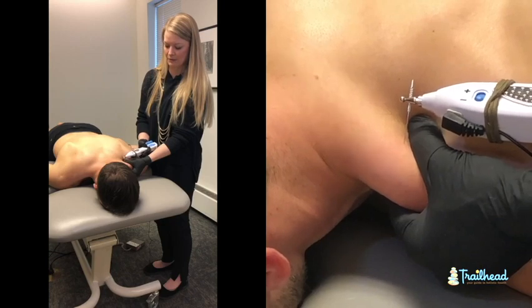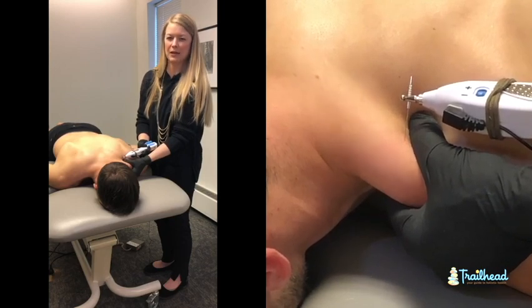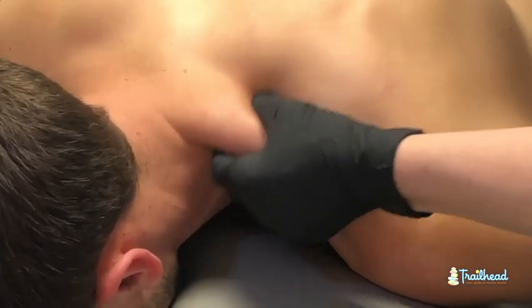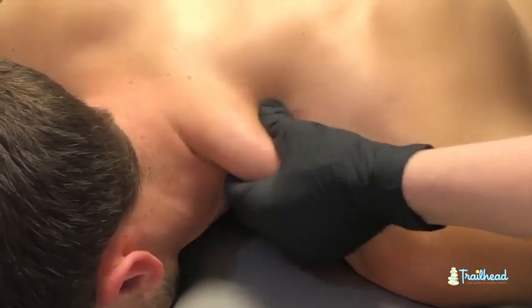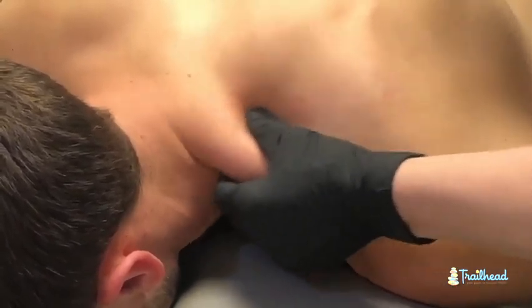We will bring that back down so it is nice and comfortable. We might let this run until Mike's sensation of cramping or aching kind of goes away or until I see a change in what I am feeling. Dry needling can have almost an immediate after effect — sometimes when the muscle is feeling really stiff, the minute we get the needle out, we have a nice healthy supple muscle.